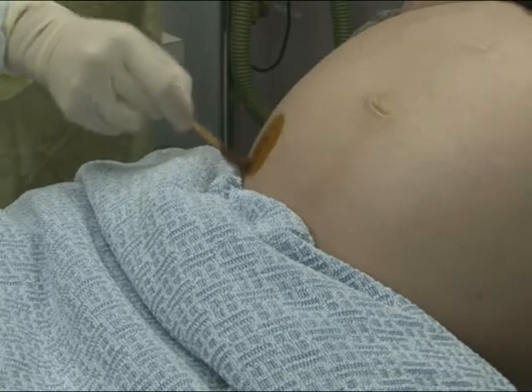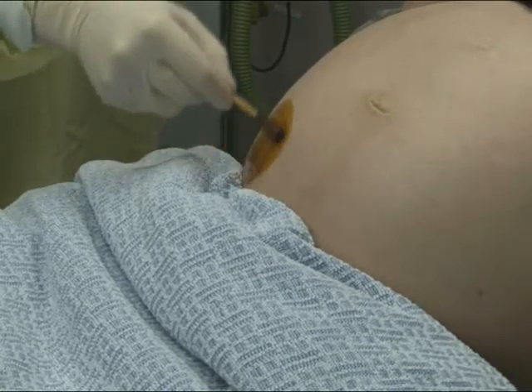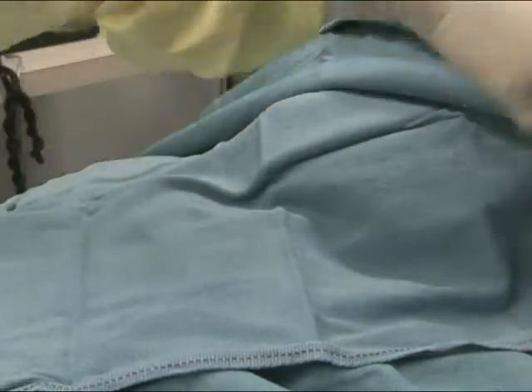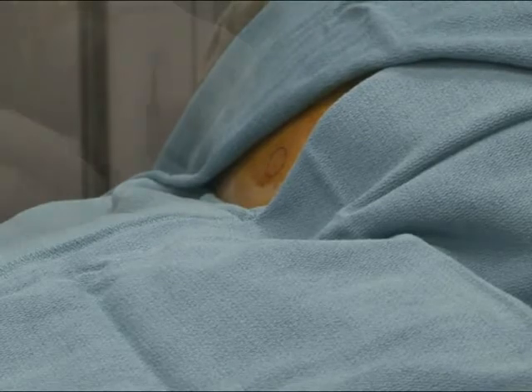Place the patient in a supine position and cleanse the site with antiseptic solution. The area is covered with a sterile protective drape. Mark the skin to clearly identify where the anesthetic block will be placed.